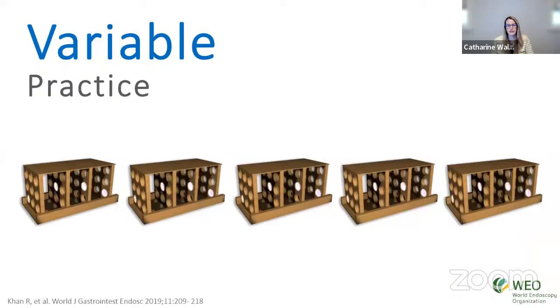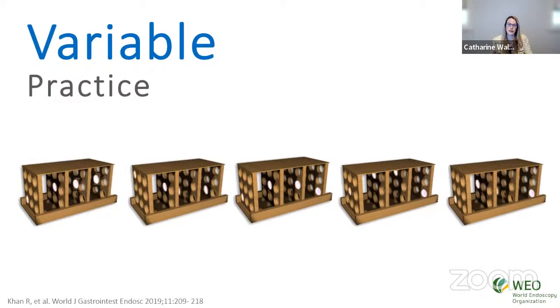Another strategy used in the simulation-based environment is variable practice. Studies have shown that varying the task during training can help to better prepare trainees to handle the wide variety of things that we'll see in the clinical setting. So instead of having trainees practice the same task over and over and over, vary that slightly so that they're exposed to a broader range of skills and situations. That has been shown to improve long-term retention of skills.